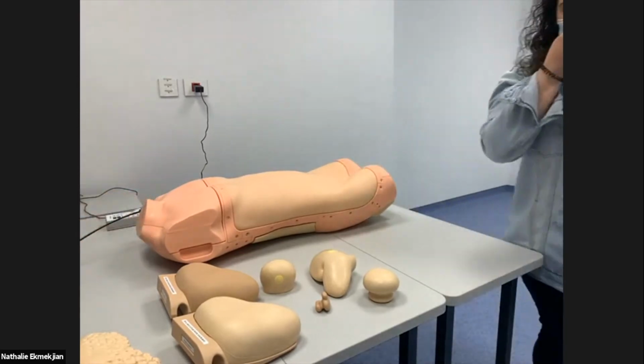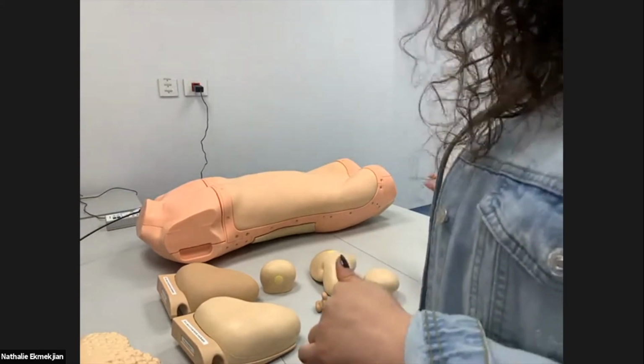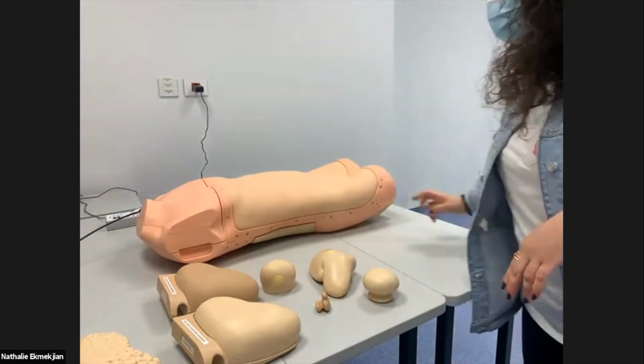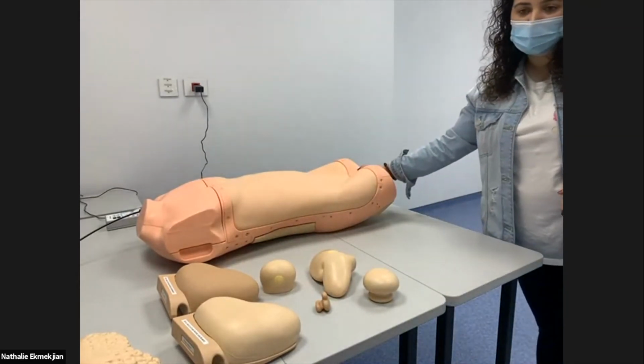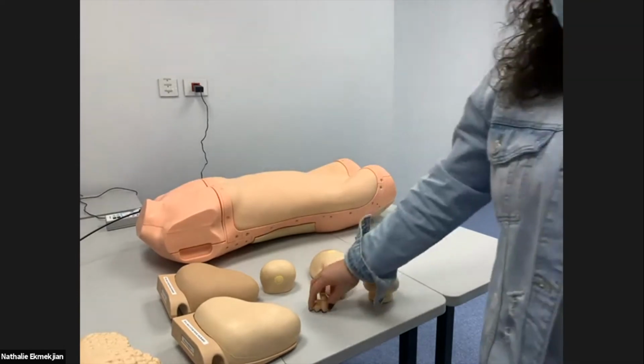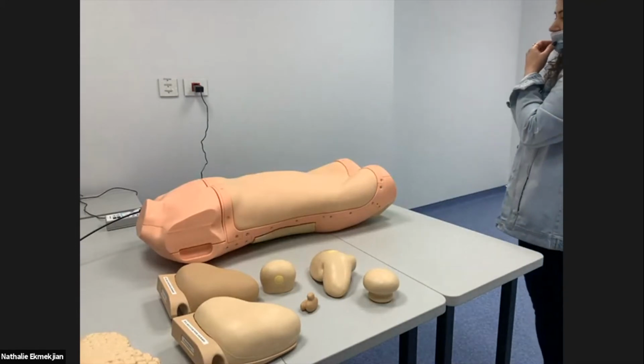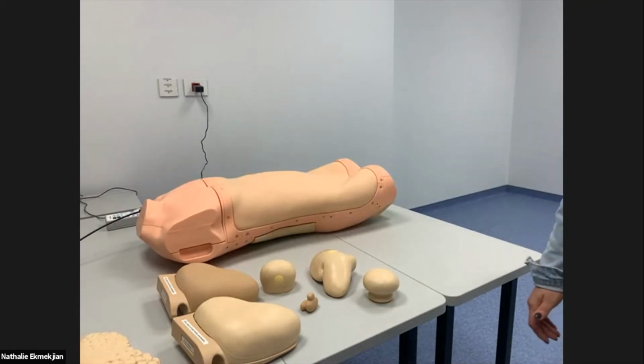Okay, so we have placed the interchangeable organs: normal liver, cyst for the kidney, enlarged spleen, and normal uterus with a normal inguinal lymph node. And we can palpate the simulator by using the foot paddle for the respiratory motion for the liver. So this is the part of the palpation. Of course, for the liver and the spleen, we can do the percussion. Now we will start with the auscultation.